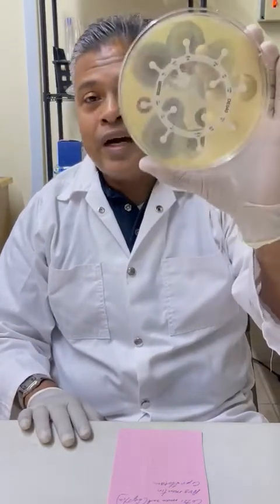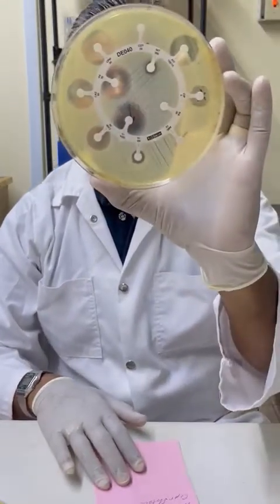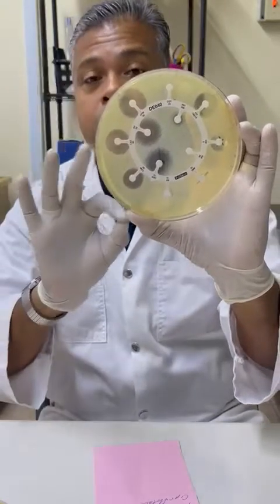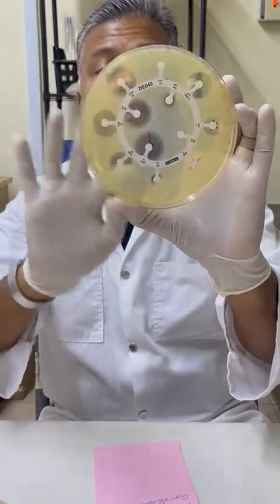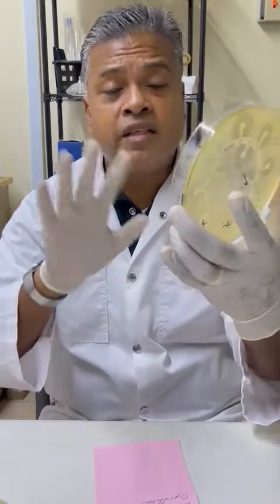One of the common ways of doing a sensitivity test is really to expose the organism to antibiotics. And I've got a few in front of me here this morning, and I want to just briefly explain to you what the sensitivity test does. Basically, we inoculate this large plate with organisms from the patient, and then we subject those organisms to a list or a panel of antibiotics. So each one of those circles here are antibiotics: cefepime, cotrimoxazole, nitrofurantoin, piperacillin, tazobactam, ciprofloxacin, etc., etc.